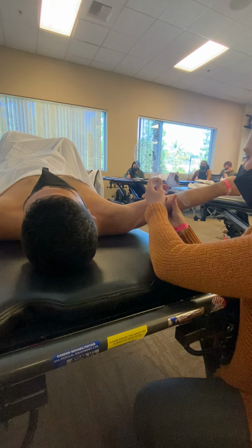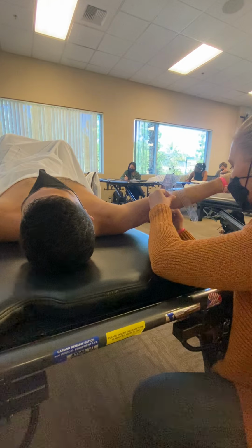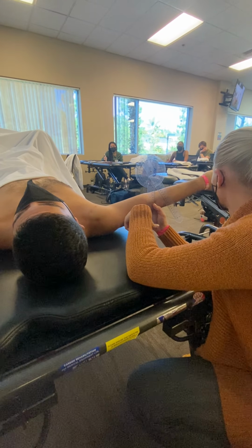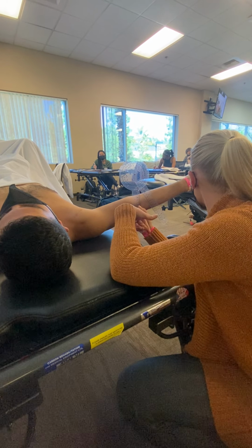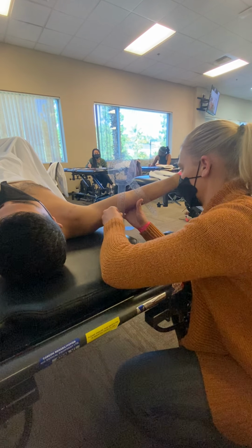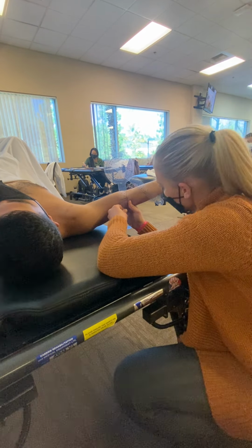Or if I don't want to mess with that, you can measure. It's a little bit harder. You're going to measure from the lateral acromion to where the table should be. Depending how far over you're able to get him from the table, then you can actually get the tape measure or your goni, whichever you're using, to touch the table, or you can just say this is coming off parallel from the table to the acromion, or excuse me, to the epicondyle. His lateral epicondyle is 11 centimeters from the table.